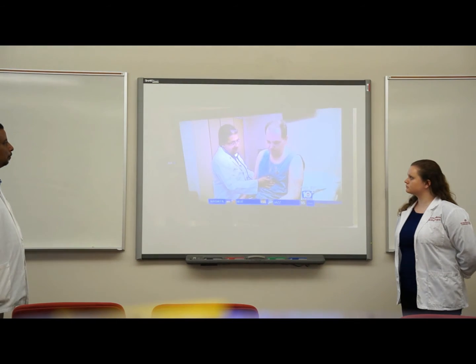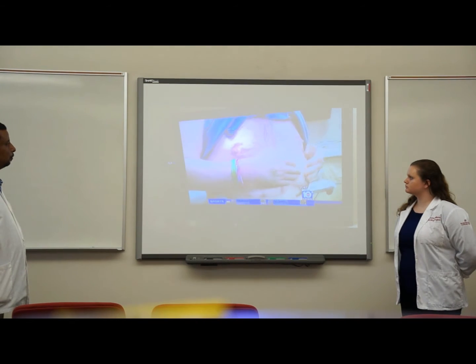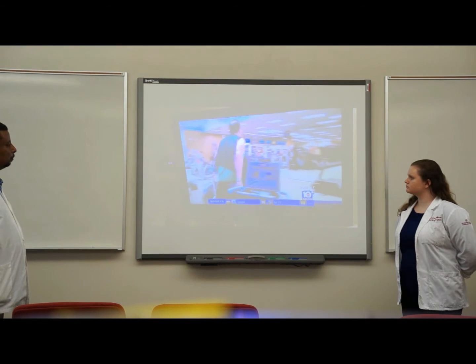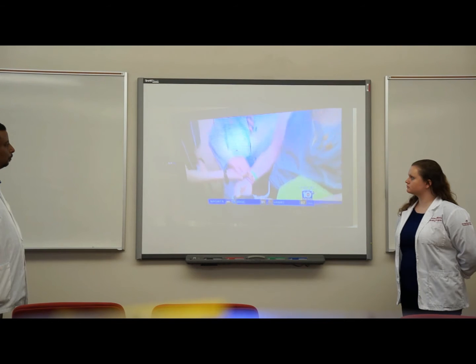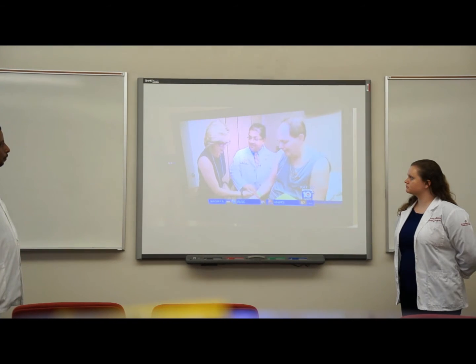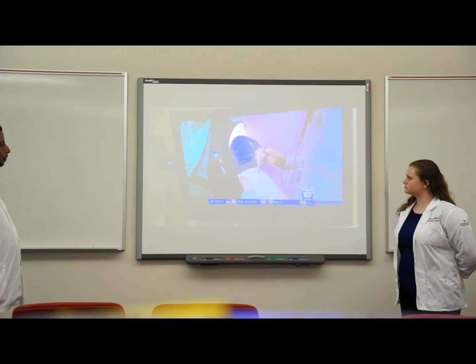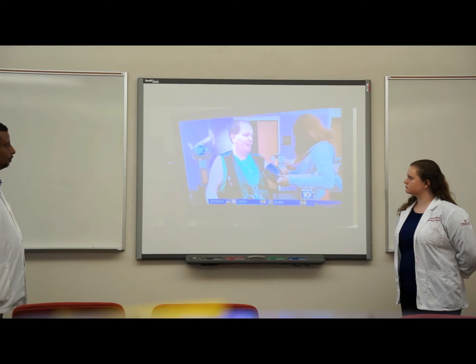The left ventricular assisted device, or Lvad, is inserted into the heart, helping pump blood throughout the body. It's connected to a battery pack that patients wear. Oh, I can see it. Yeah. If you can find one. If I can find one. I'm sorry, I can't find one. No, he doesn't have one. In fact, Ken doesn't even have a real pulse. His blood flows continuously through his body thanks to that device.